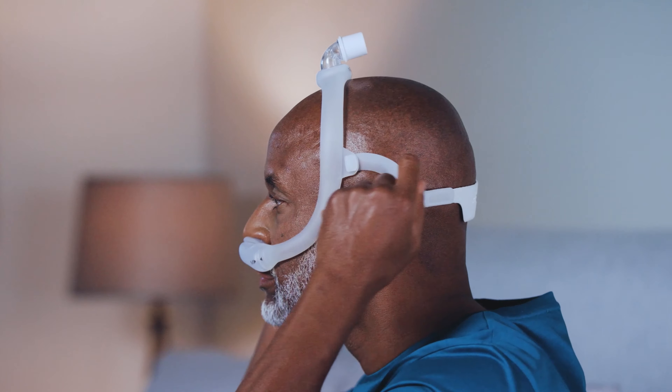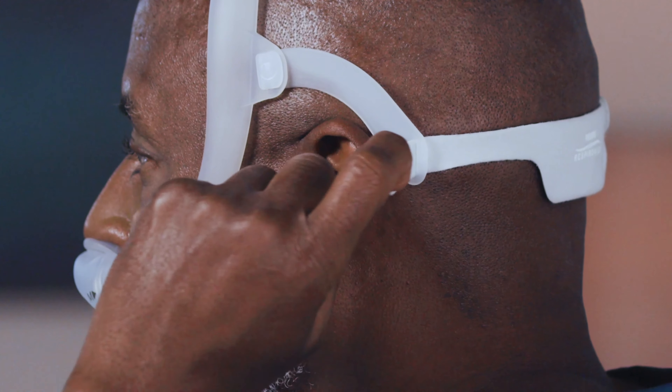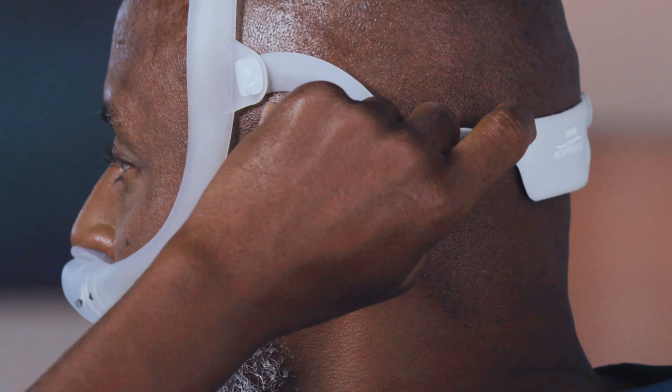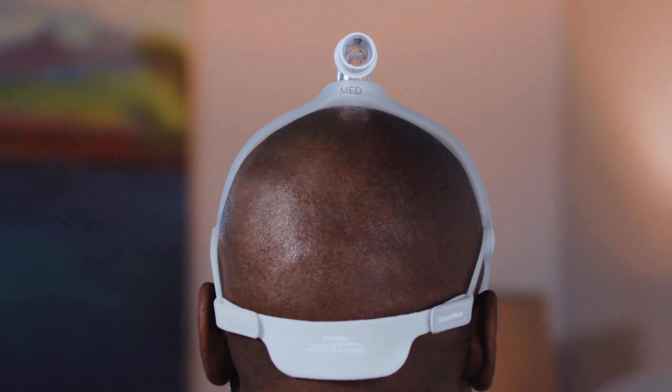Peel the headgear tabs away from the fabric strap. Adjust the length of the straps evenly until the mask feels pleasantly snug. Press the tabs back against the fabric to reattach. Do not over tighten.